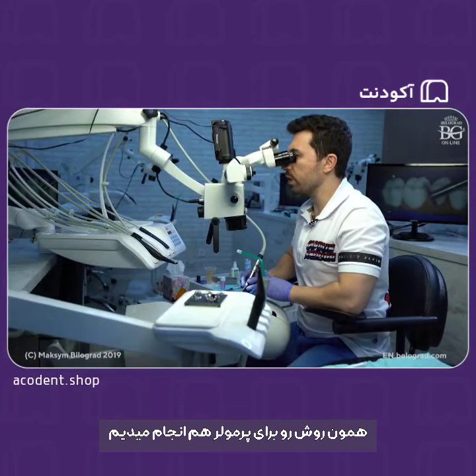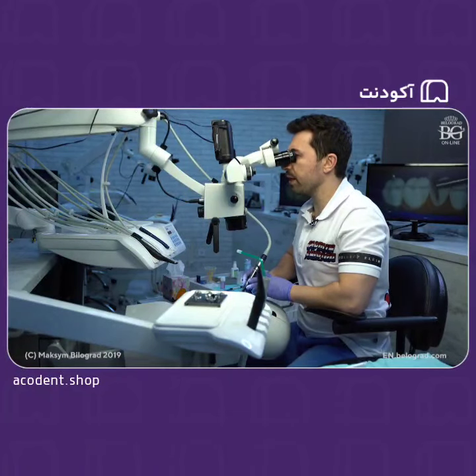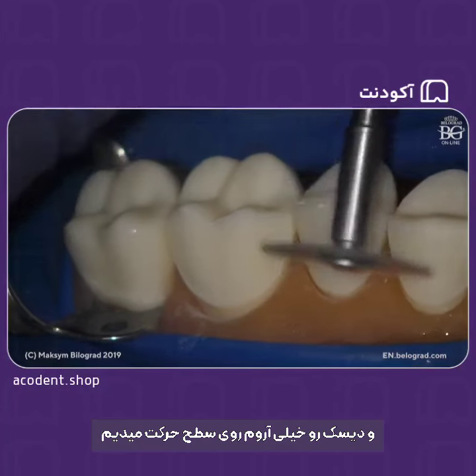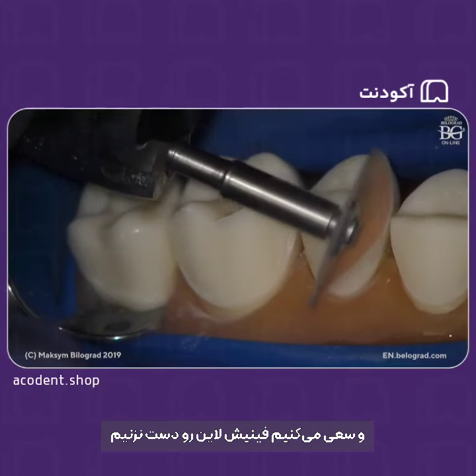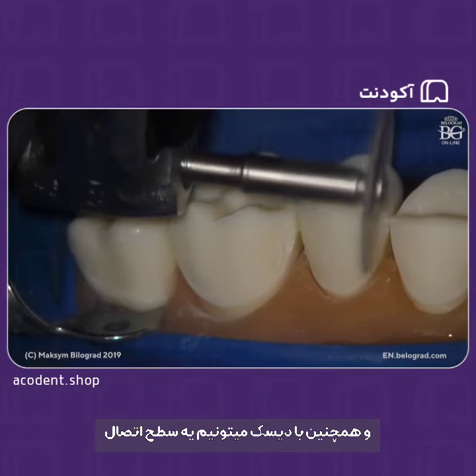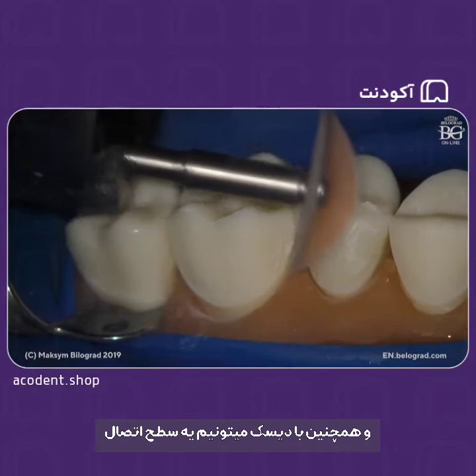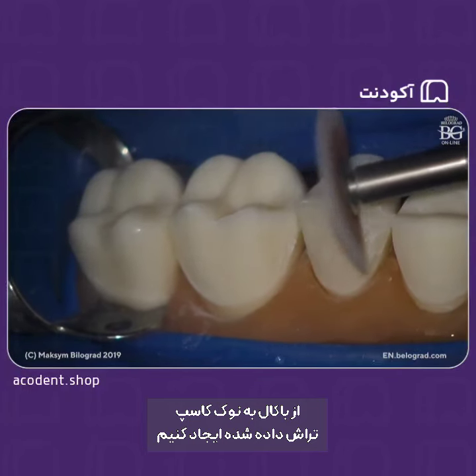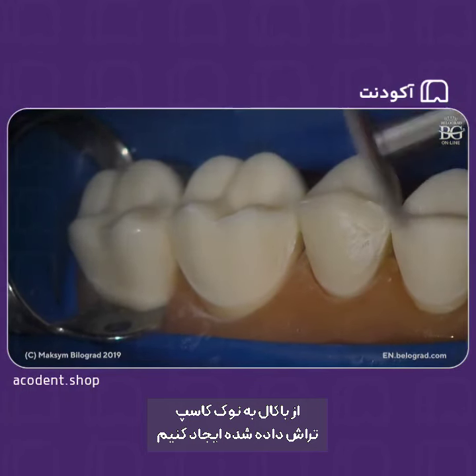Same will be with the premolar. Okay, so we move our disc gently over the surface, trying not to touch finish line. And also, you see, with this you can make transition from buccal surface to tip of the cusp that we prepped.